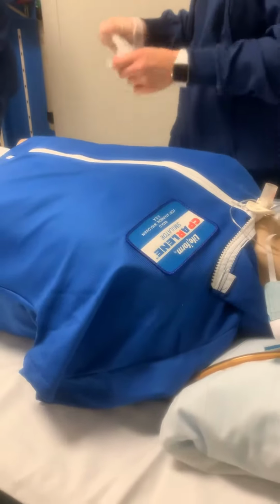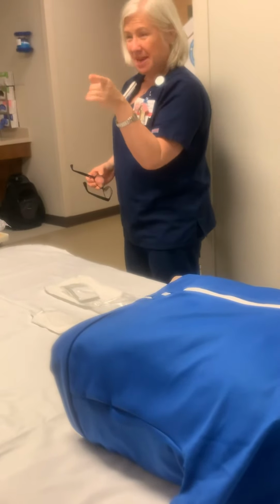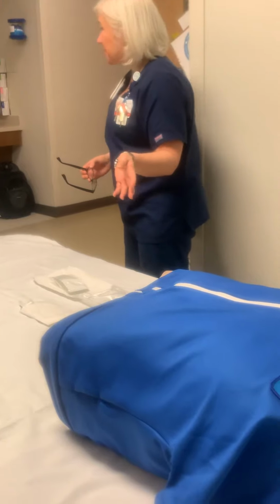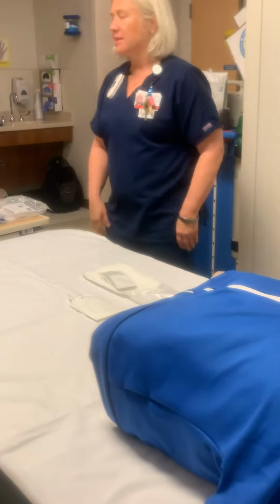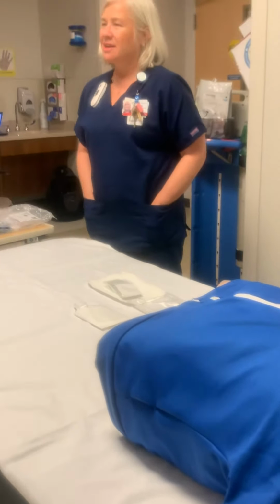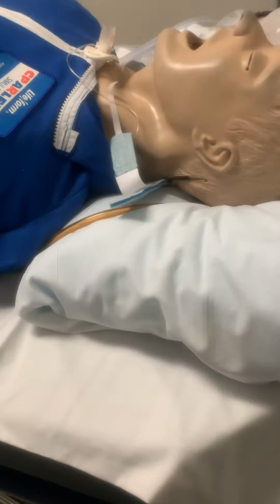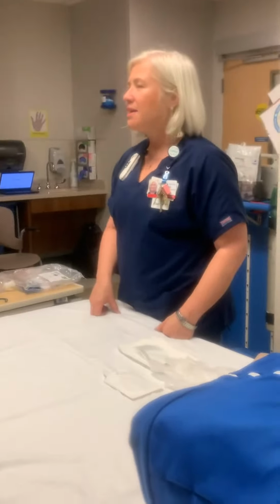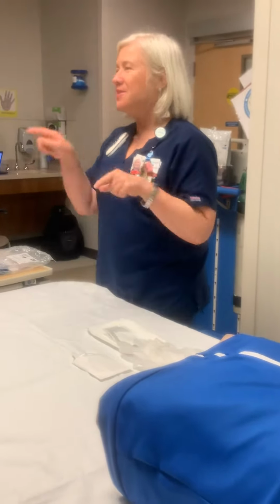So those are our altered airways, what you're going to deal with here, and then we just need to get the pediatric mask in there. Yes, because you definitely need that in the event that your patient codes. Because I was under the delusion that these things had both in here. They used to. When I first got to Gateway, we used to, but I think they're out of the system. It's just the Ambu with the adults. That's disturbing. I would not have known that. Yeah, that's why we do these things.